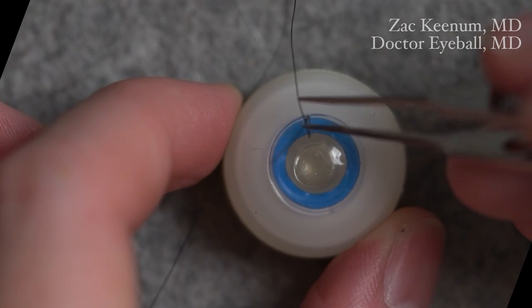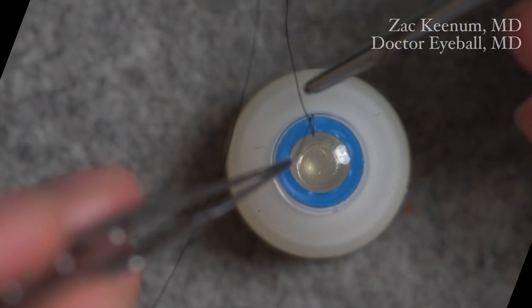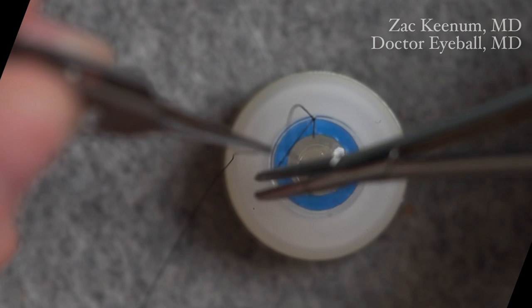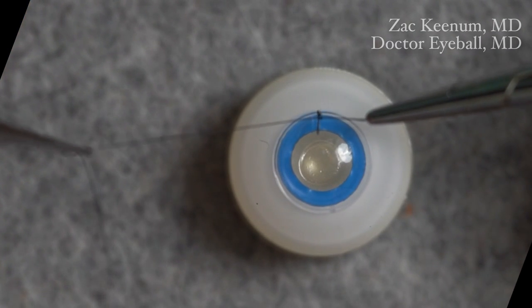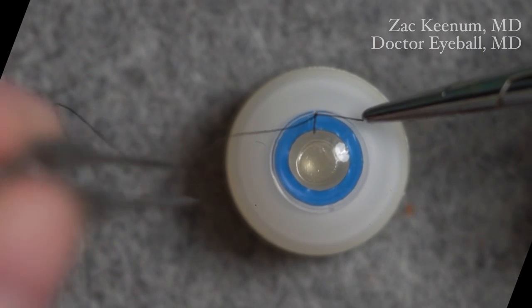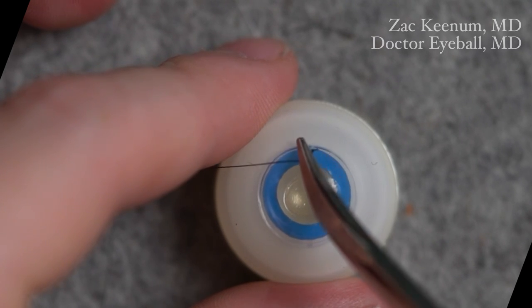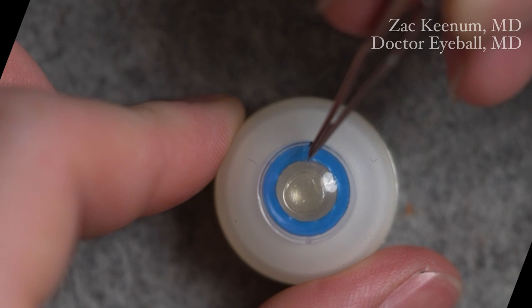After those two throws, we've created the slip knot. You can loosen it as I'm doing here, and then re-tighten it as needed. That allows you to tighten and loosen as you go during open globe surgery. For the last knot, come from the inside again like a regular throw, grab the short tail, and pull 90 degrees. That completes it — a 1-1-1 slip knot. Then simply trim the tails and bury the knot within the cornea in the usual fashion.